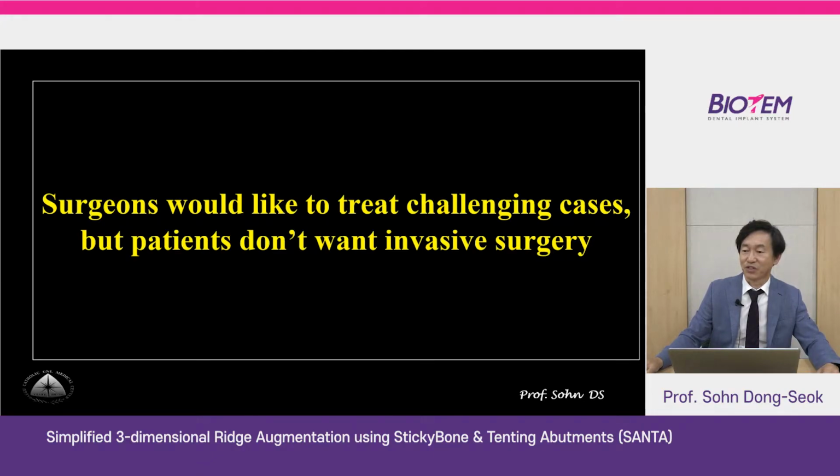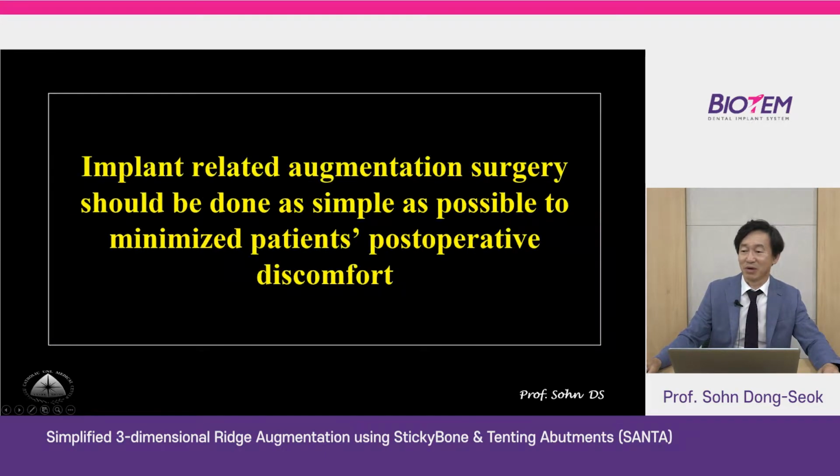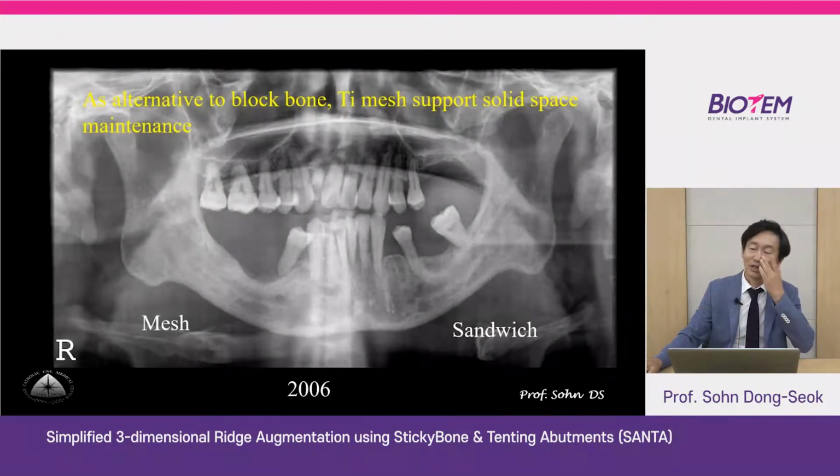Surgeons would like to treat challenging cases with complicated surgery, but patients don't want invasive surgery. So implant-related augmentation surgery should be done as simply as possible to minimize patient postoperative discomfort. As an alternative to block bone, I moved to titanium mesh to support solid space maintenance.